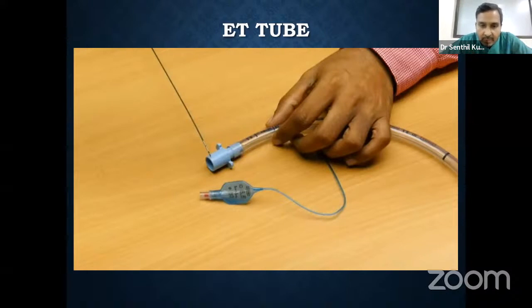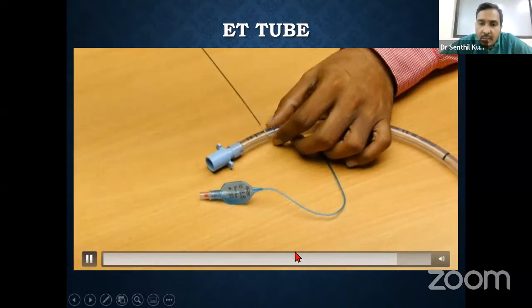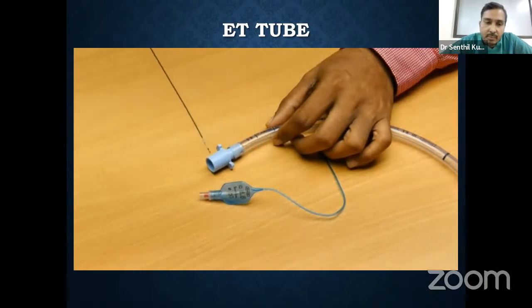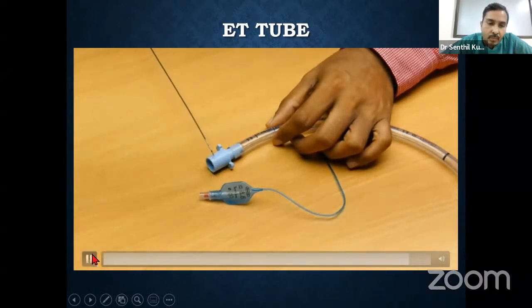When the cuff resting diameter is more, it is going to provide less pressure for the volume, so tracheal mucosal injury can be reduced. That is the purpose of the cuff resting diameter. The previously used red rubber tube has a very low cuff resting diameter, so it will apply more pressure on one particular point, whereas this type of tube will apply uniform pressure over a wider area of the trachea.